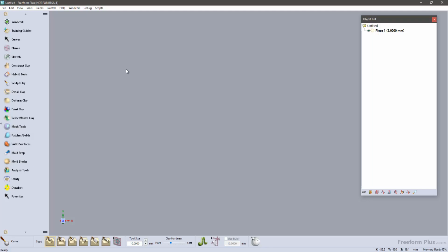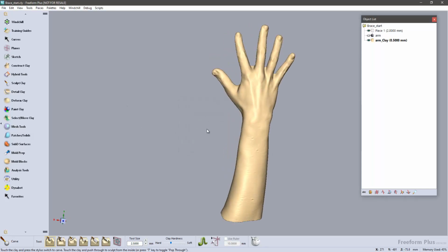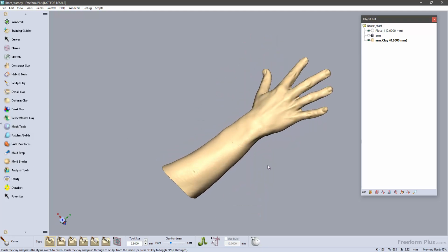Here's a demonstration of using Dynabot as a workflow tool in order to complete a workflow using Freeform. I'm going to load my initial piece, which is a scan of a hand. This here is going to create a wrist brace. So it's a similar workflow. And the Dynabot I have created, I am also going to drag from off screen.